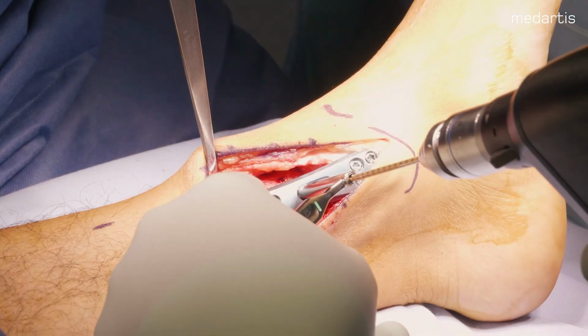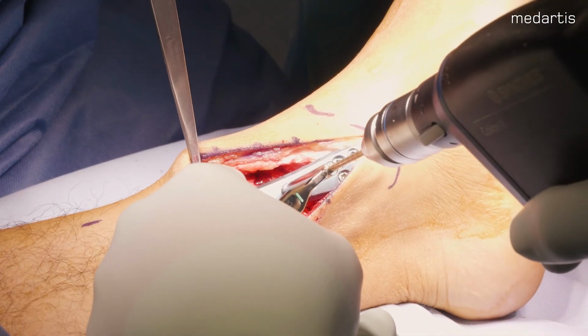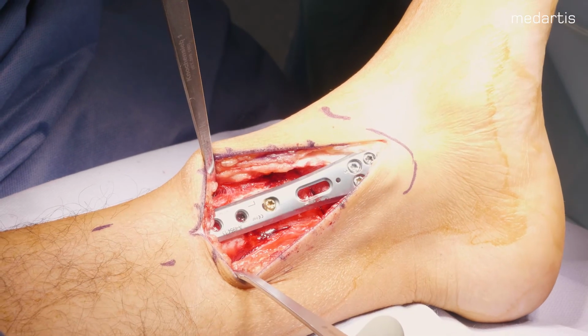A second 3.5 cortical screw in the oblong hole helps to adapt the plate to the bony anatomy.